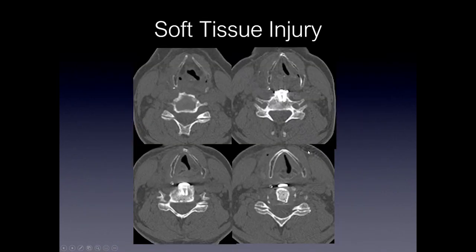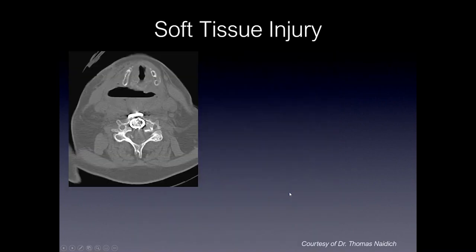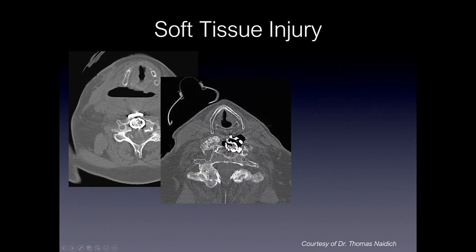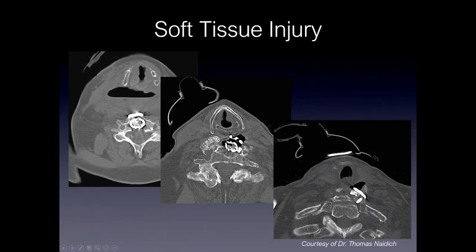Finally, soft tissue injury can occur. In this ACDF performed in the cervical spine, there was a breakdown in the construct. You can see a large collection along the esophagus, and the construct actually migrated into the esophagus, resulting in erosion of the posterior wall of the esophagus.